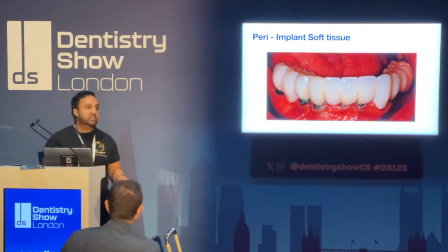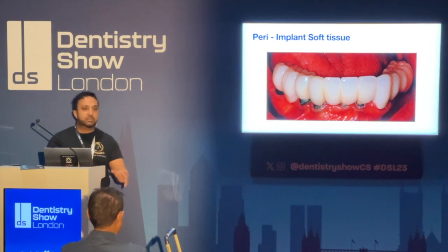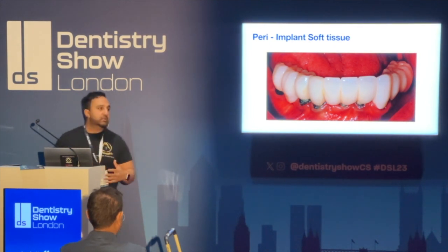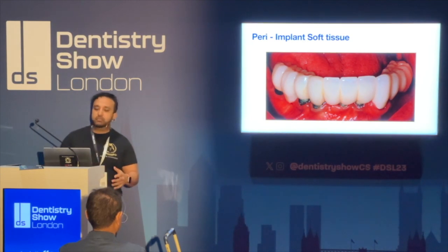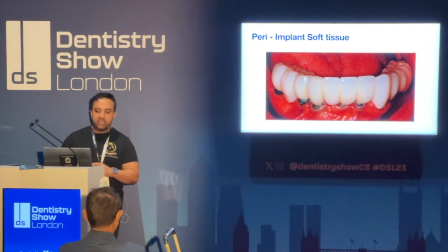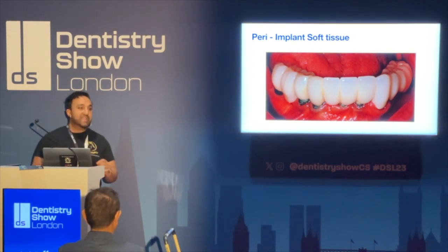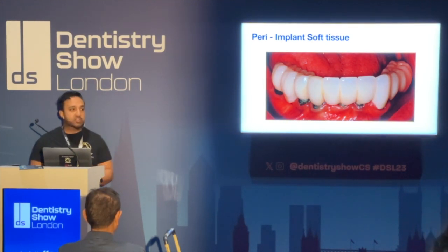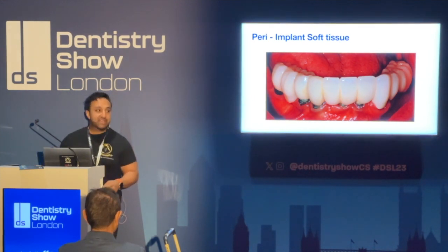When you have plaque retention factors and a solid implant, the bottom of the implant will actually be osseointegrated, but the top of it is going to be something that will retain plaque. That then can cause inflammation. So simply by cleaning the plaque up, giving the patient oral hygiene instruction, smoothing those threads out, and teaching the patient how to brush and use a TePe in between and underneath the bridge, may give that patient a few more years survival with this particular bridge.